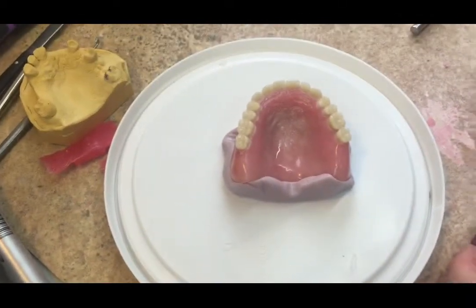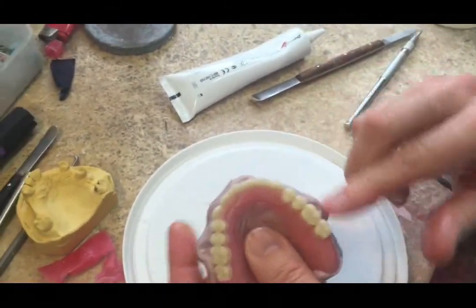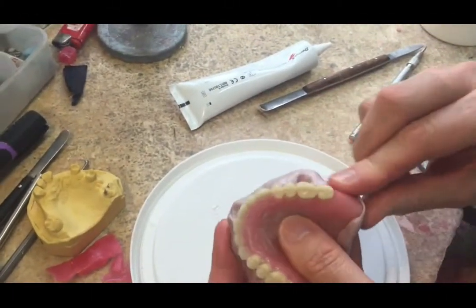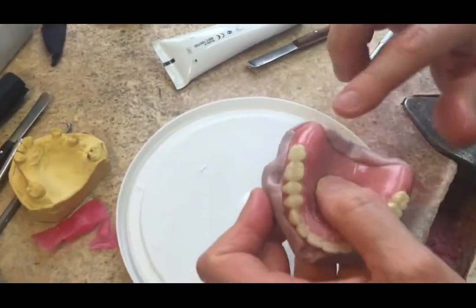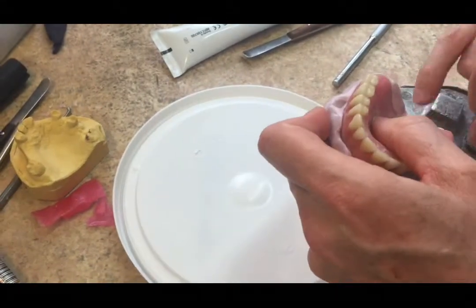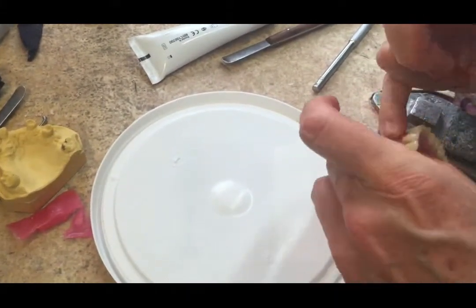We let that sit and we'll come back to do the top half. What we're doing now is smearing on a small amount of Vaseline so that there's no possible way the two layers of silicone will bond to each other. We don't want too much because we want to try and be as accurate as possible.